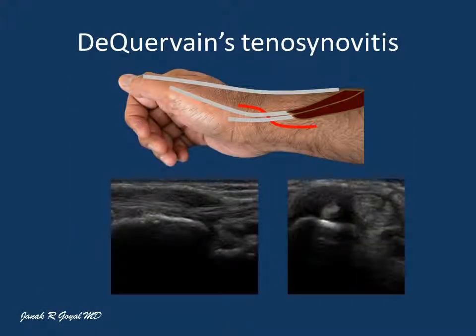De Quervain tenosynovitis is caused by thickening of the extensor retinaculum on the first extensor compartment. An accessory septum may separate the tendons of the abductor pollicis longus and extensor pollicis brevis into two separate compartments, and the inflammatory process may involve only one of the compartments, and sonography helps to direct the needle into the compartment involved in the pathological process. The needle can be inserted along the long or the short axis of the tendons.